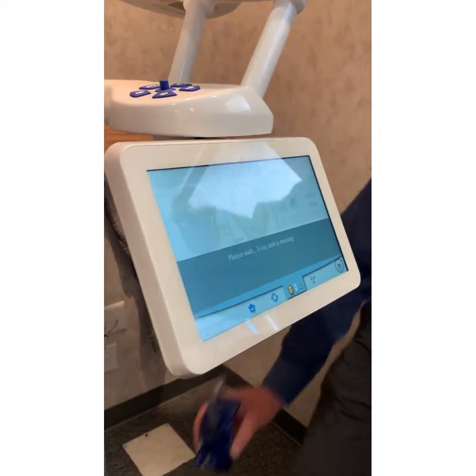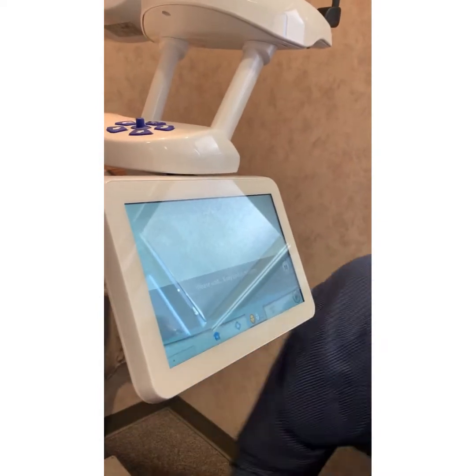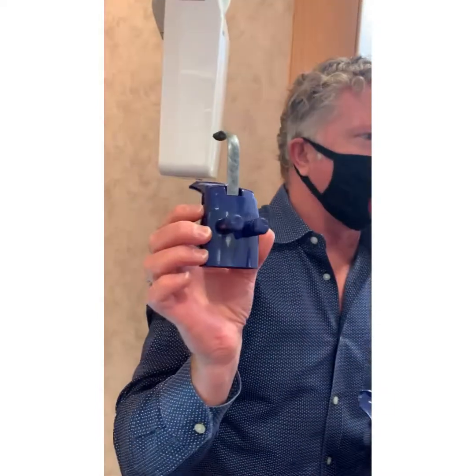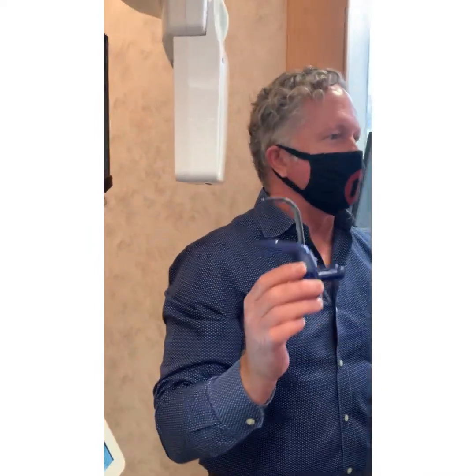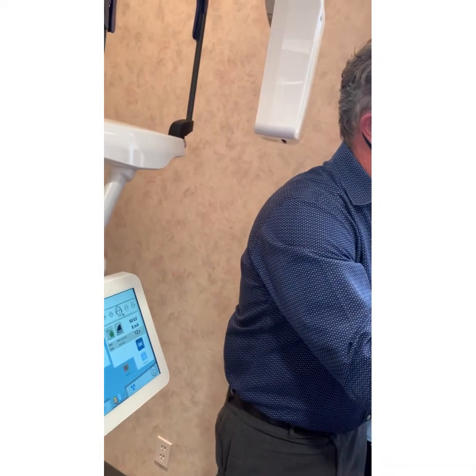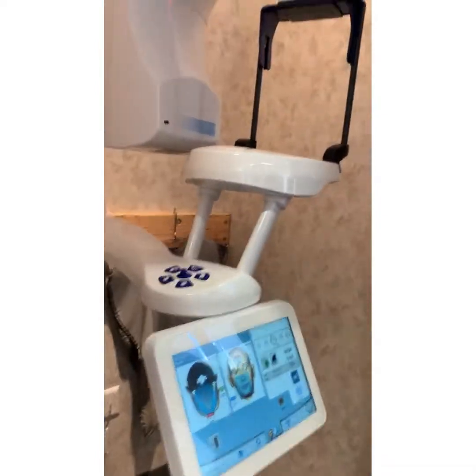this is where you're going to bring the patient into position. The white face is the one without the exposure. This is 2D. This is 3D. 2D has fixed geometries. You don't want to raise the patient up and down. With 3D, if you pull this out, it's kind of a spring, but you have the ability to move the patient up and down in the chin rest.